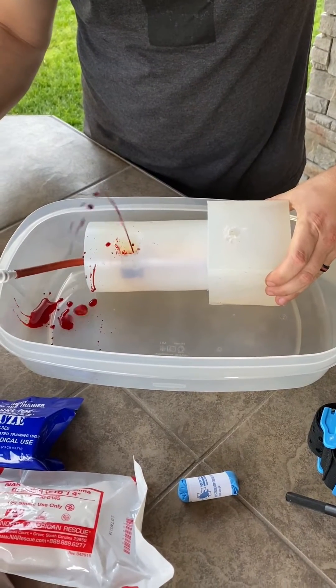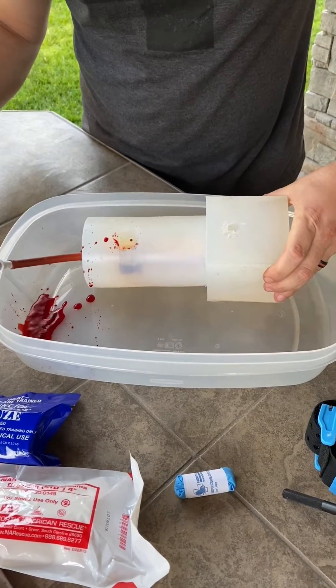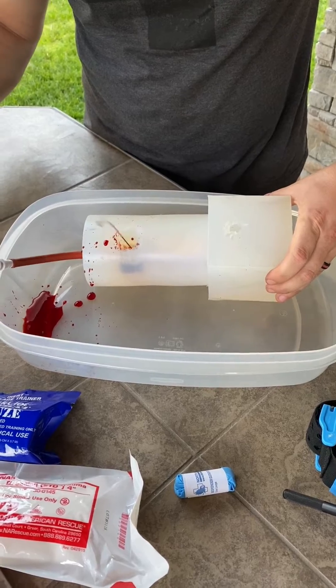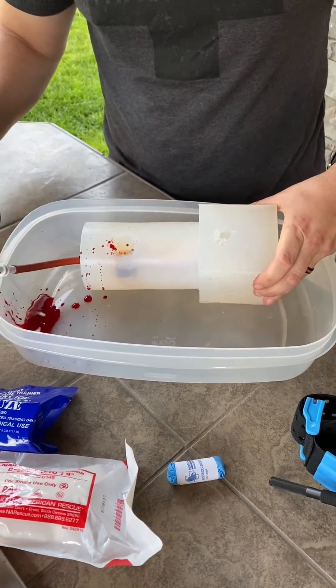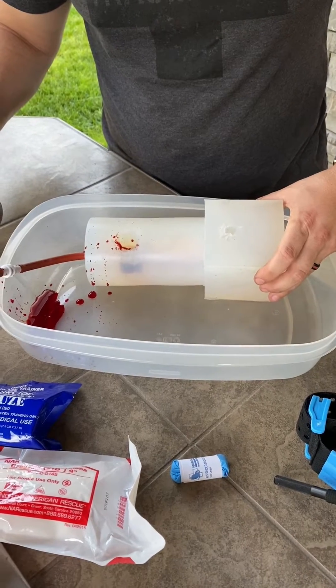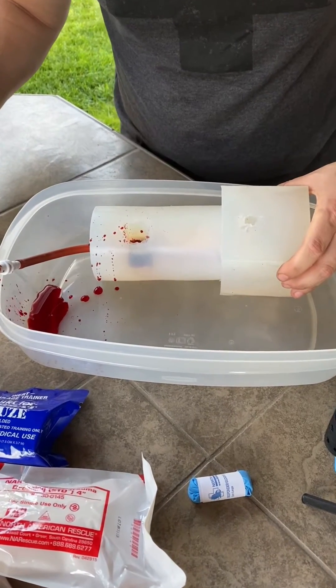We're going to talk about tourniquet conversion. Here you see an arterial bleed. It could be squirting as you see here, or it could simply be pooling in the cavity because it's blocked by tissue or other mass. So not always squirting.